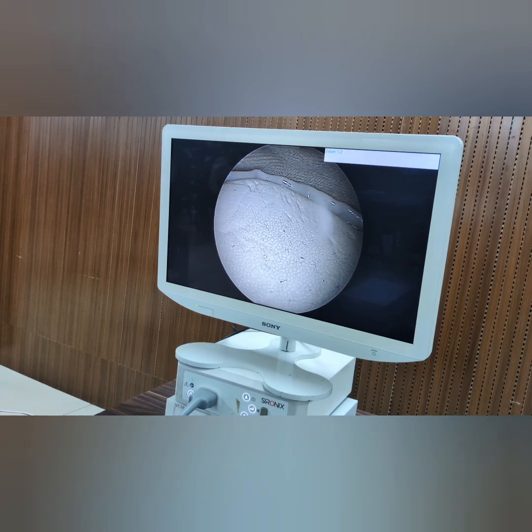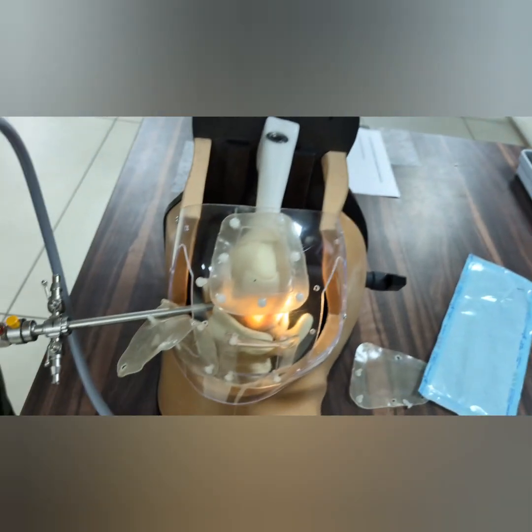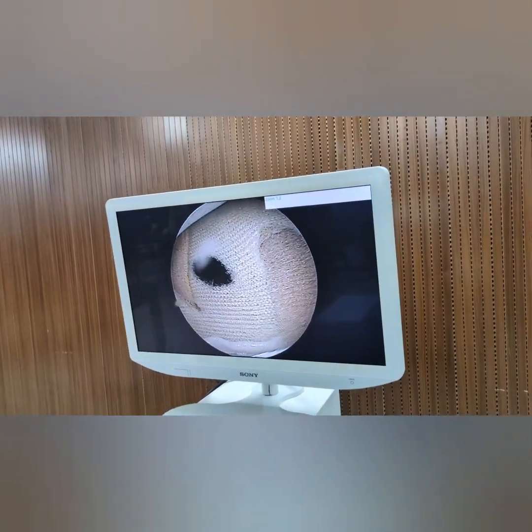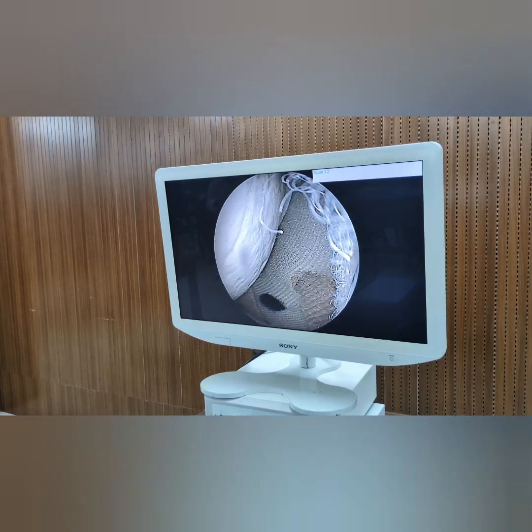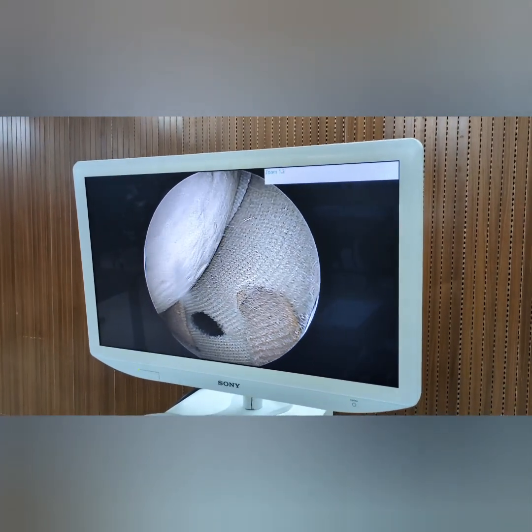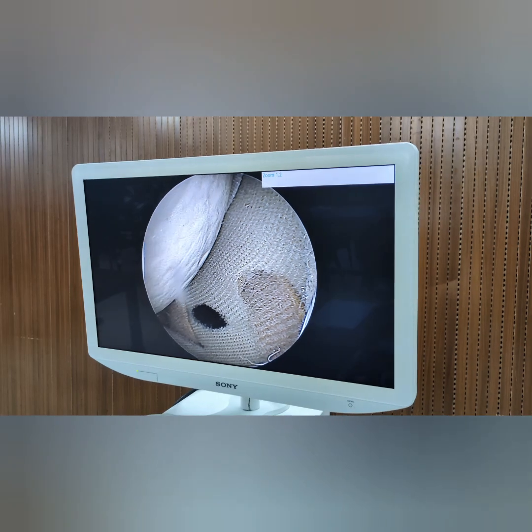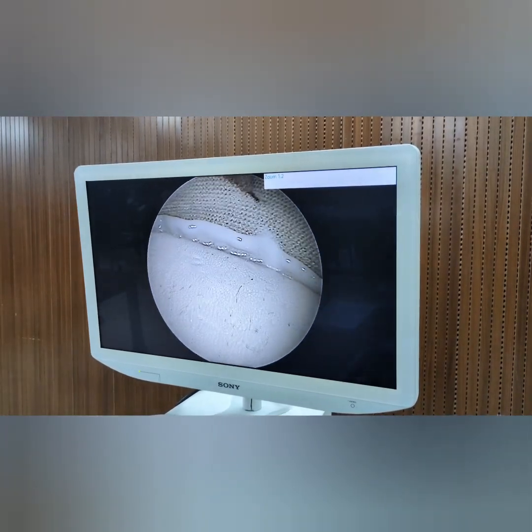And so we got all our, and we have to see our rotator cuff insertion. So can you see that rotator cuff insertion, that white structure? That is our rotator cuff insertion. Okay, so I hope you got all the points from the posterior portal.